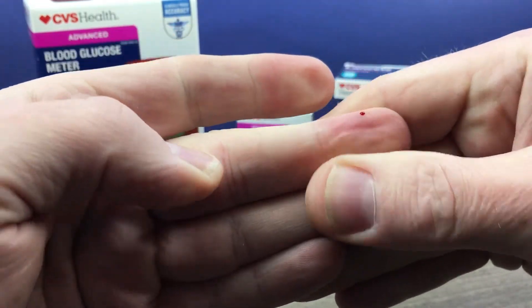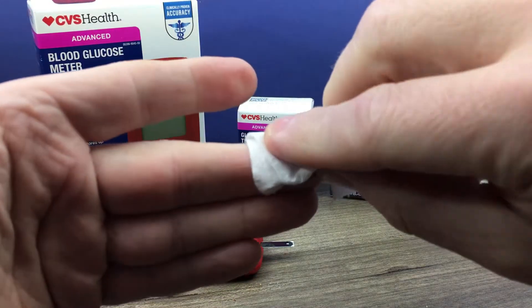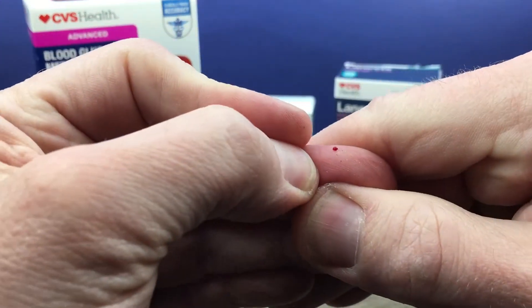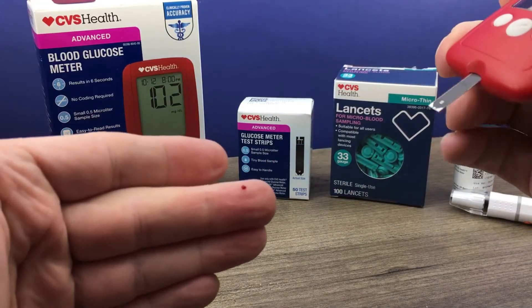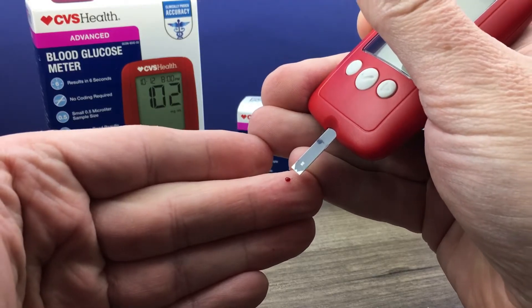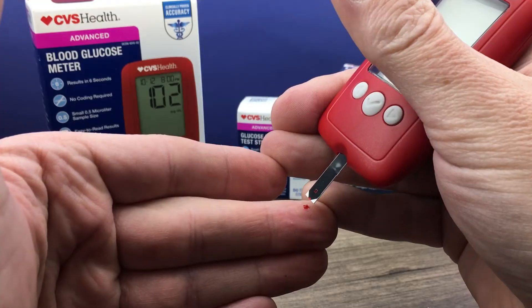Is there a drop of blood? They do recommend that you wipe away the first drop with a clean tissue, in case there are oils or lotion on your skin that may affect the test. Then you'll get a second drop of blood ready to go. You touch the test strip to it — it does not get applied to the strip, you touch the strip to the blood — and that is slowly drawn into the test strip.